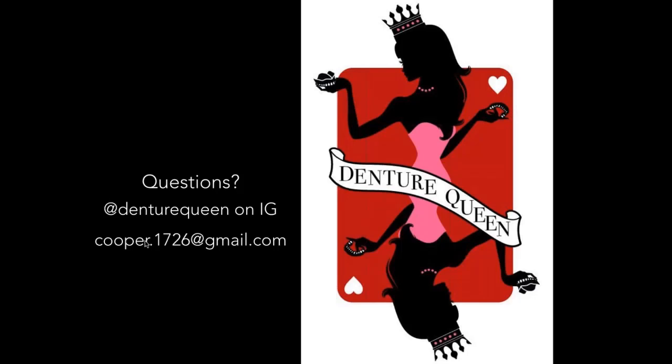If you have a single arch, let's say it's a maxillary denture and a mandibular natural dentition, you can scan the maxillary tissue surface with the Trios, scan the lateral surfaces of the teeth the way that I do it in my video, and then scan the opposing dentition in the mouth, and then scan the two in occlusion. So you're scanning in the mouth for the opposing and the bite, but you're also scanning the denture separately in your hand.